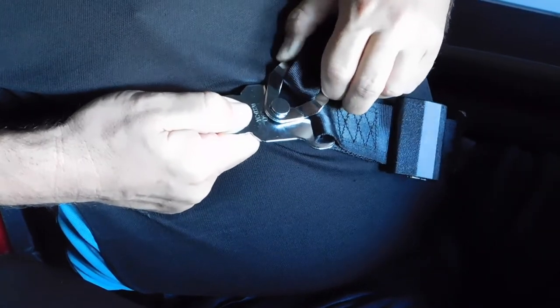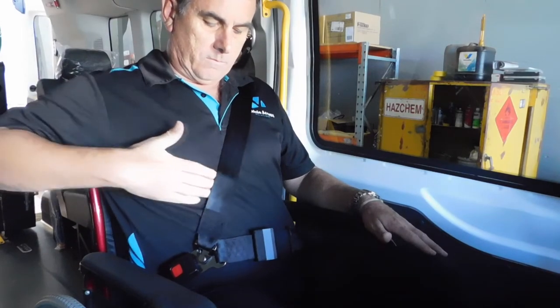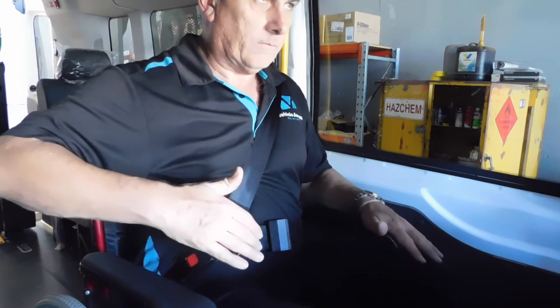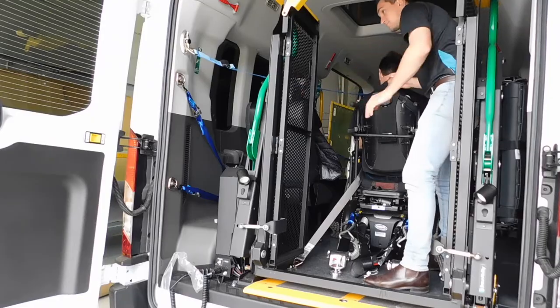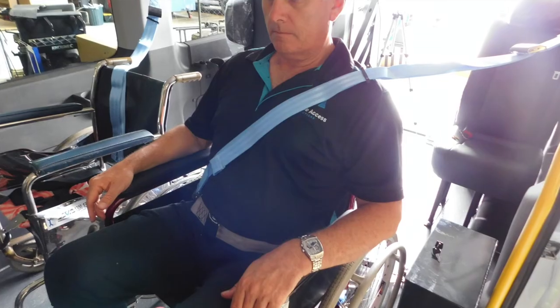You will put this belt over their shoulder and attach it to the lap belt. The static sash belt should be tight but allow about a hand width of room. Tighten the belt as needed and then check over everything prior to continuing your journey.